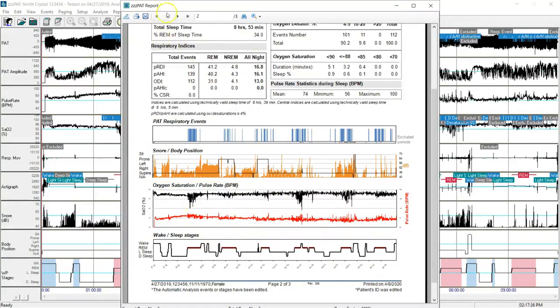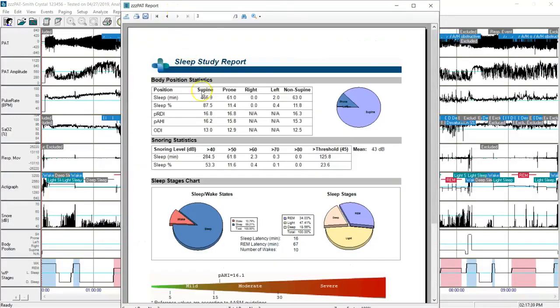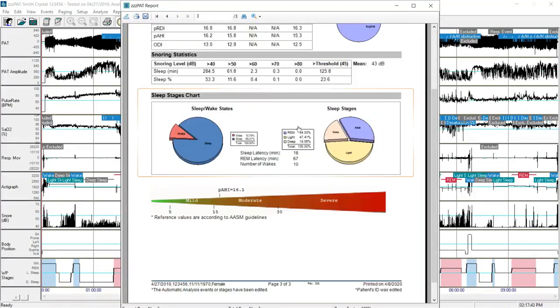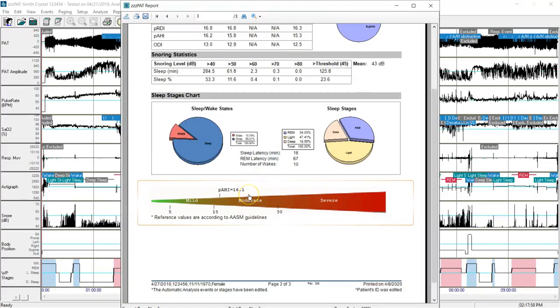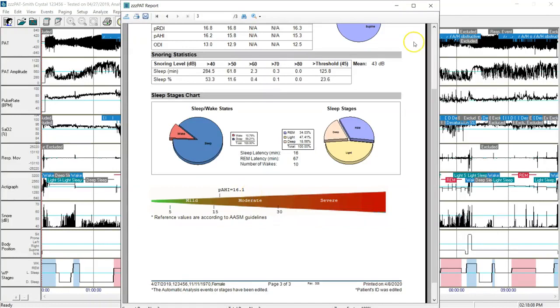I click to go to page three up at the top. And I can now review body position statistics, snoring statistics, and my sleep staging chart. I can look at the bottom and see that the patient fell into the moderate category with an AHI of 16.1.